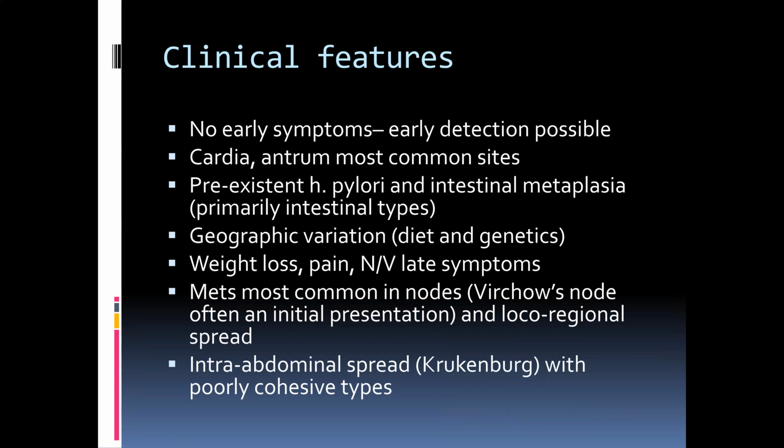Sadly, we don't have really optimal immunohistochemical characterizations that allow us to say a tumor originates in the stomach when we find a metastatic lesion and don't know where it came from or started. So that's one of the weaknesses. We can often say sort of upper GI tract and so forth, but we can't always say this is a gastric cancer that's metastasized to the such and such.